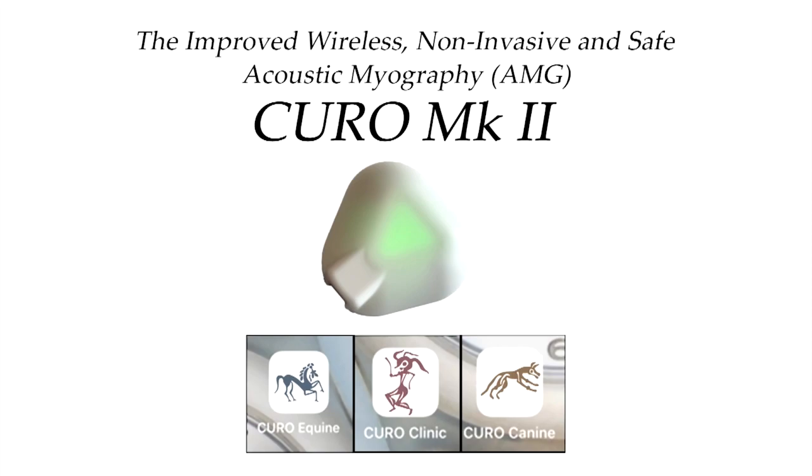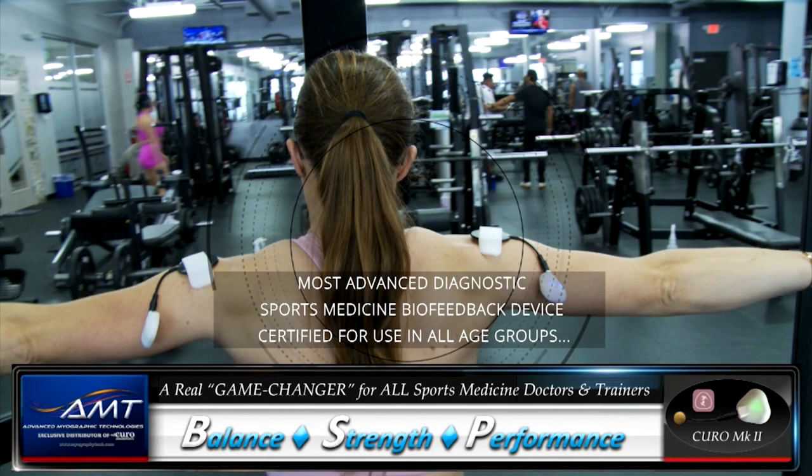So good afternoon, everyone, and I hope you can see the slides because I'm showing them. First slide is just a representation of the transmitter for the CURO Mk II. It connects to the sensor, which is on the body, and then it transmits either using Bluetooth or Wi-Fi capability. We can actually go live to a satellite and then transmit it to anywhere in the world.